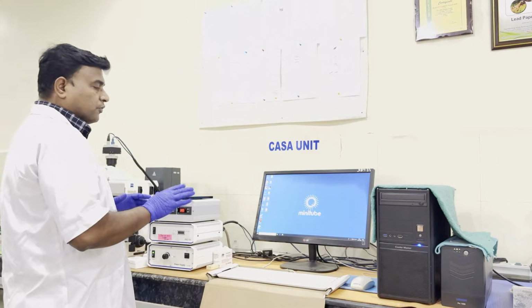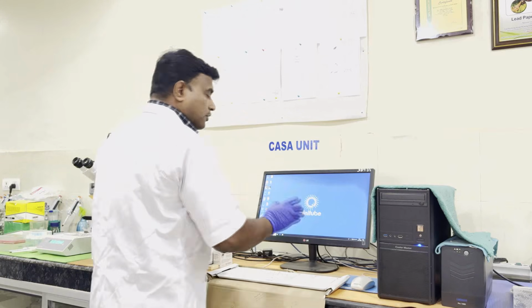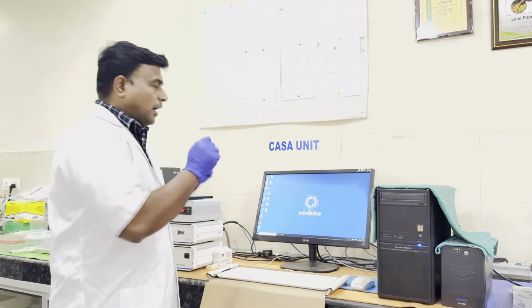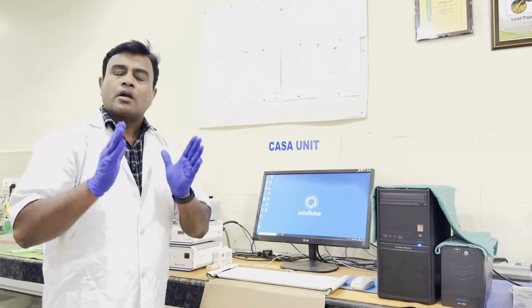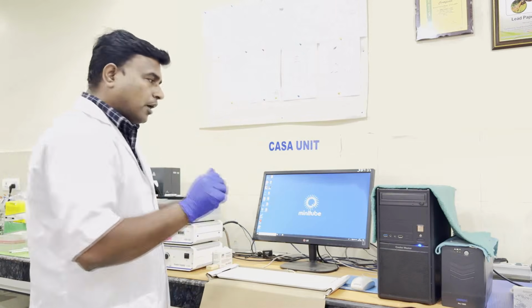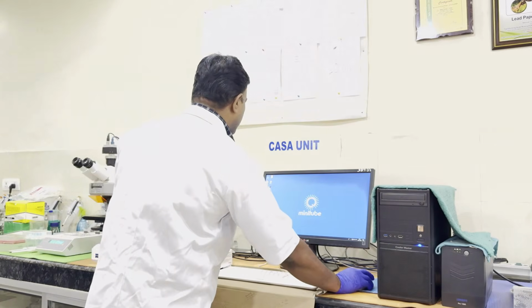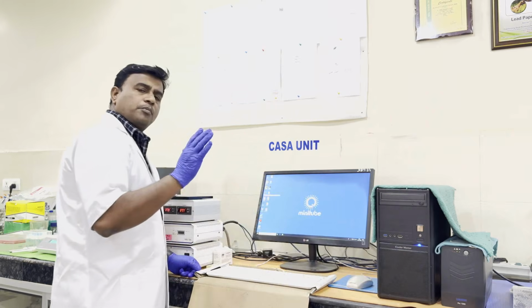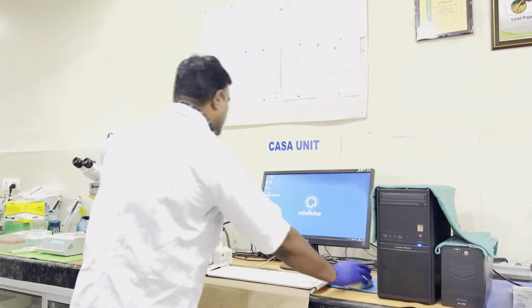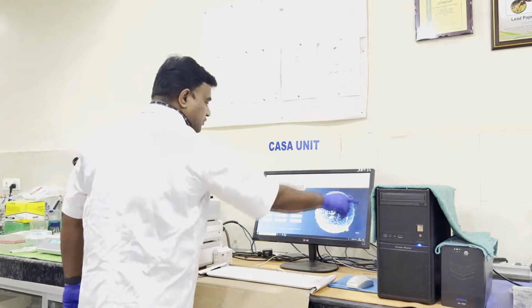Next I am coming to the setup. Here the computer is loaded with the Minitube software. It varies from software to software, but I am showing the Minitube one as a common CASA application. All CASA work on the same principle, but operational differences may be there. Here is the interface, and this CASA from Minitube is the Androvision. The software is Androvision, and what I am doing now is just double clicking the Androvision, and the interface will open.